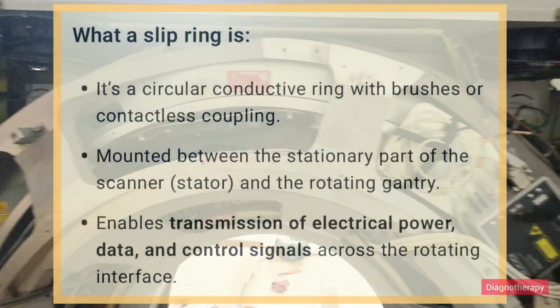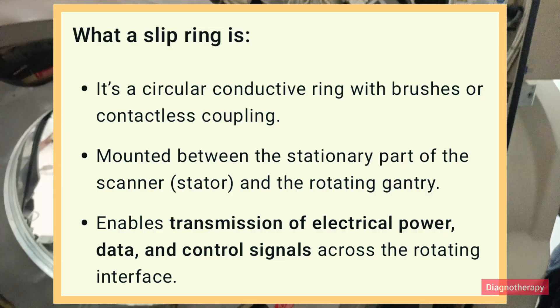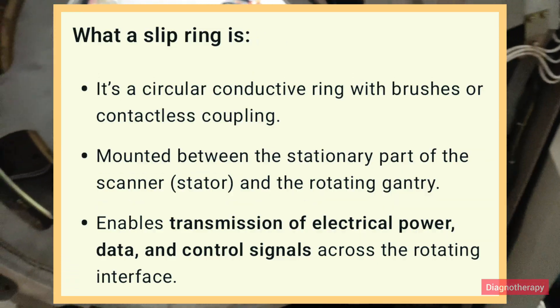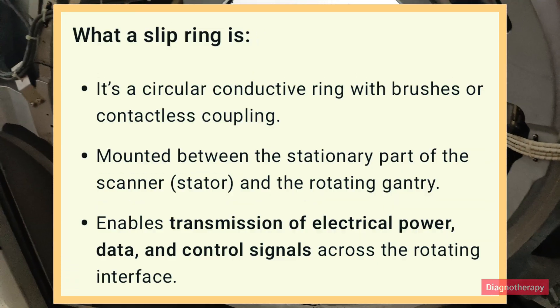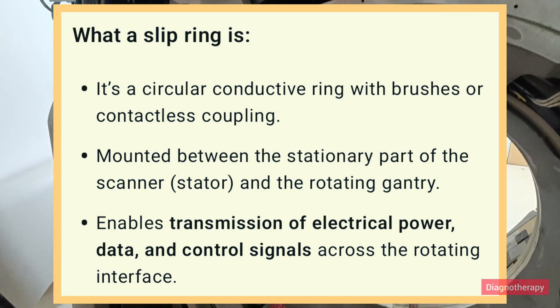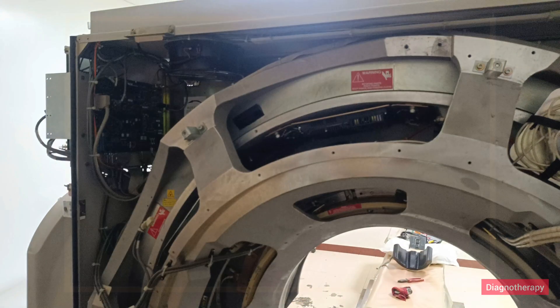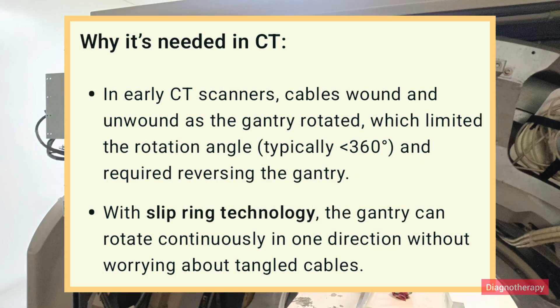In short, what is a slip ring? It's a circular conductive ring with brushes or contactless couplings mounted between the stationary parts of the scanner and the rotating gantry, enabling transmission of electrical power, data, and control signals across the rotating interface. A big question is: why is it needed in CT scanning?